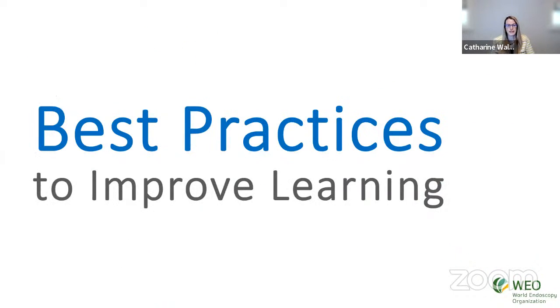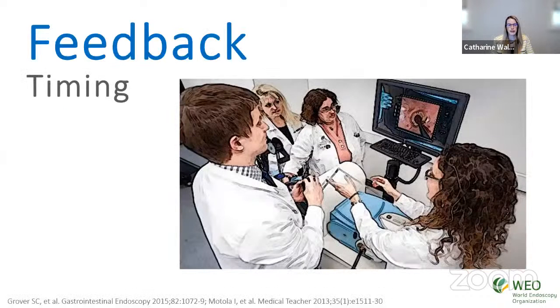So now that I've discussed how to choose a particular simulator, I'm going to discuss some of the other things that we can do in terms of best educational practices to try to make a simulation-based session as effective as possible. So one thing is around feedback, and there have been tons of studies to show that feedback is really the critical component of learning in a simulation-based environment. And if you don't have feedback, you won't learn adequately.